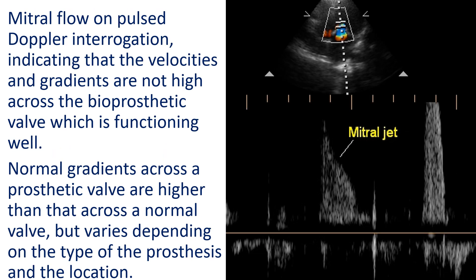Mitral flow on pulsed Doppler interrogation indicates that the velocities and gradients are not high across the bioprosthetic valve, which is functioning well. Normal gradients across a prosthetic valve are higher than those across a normal valve, but vary depending on the type of the prosthesis and the location.